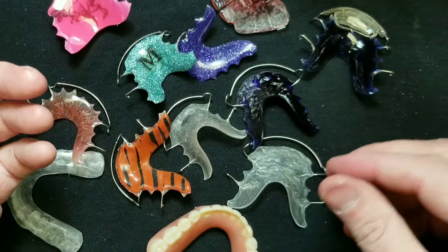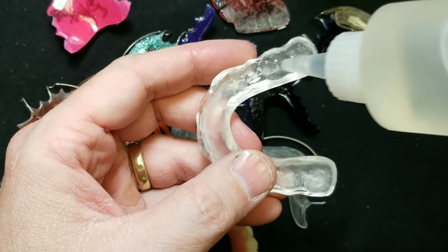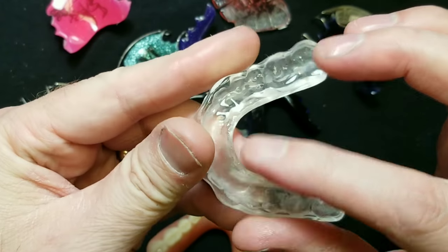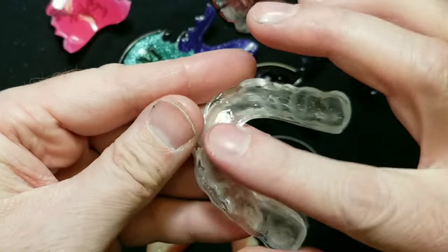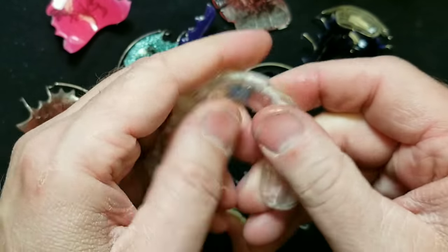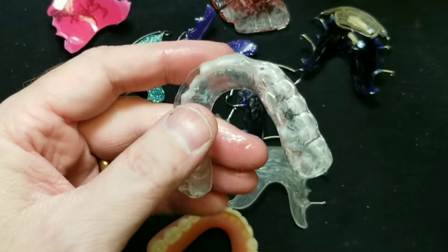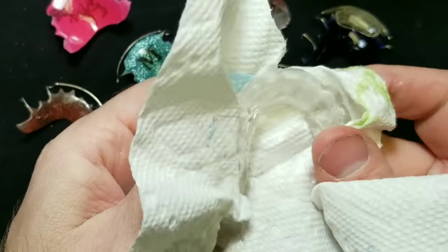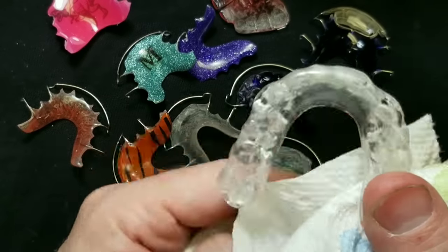You can do this with any appliance. You can do it on night guards. What I do for night guards is I just let it seep in and fill all the teeth. I do both sides and it turns it into like a glass look. Take a paper towel and clean it all off because you don't want it to be oily. You just want it to get that high shine.